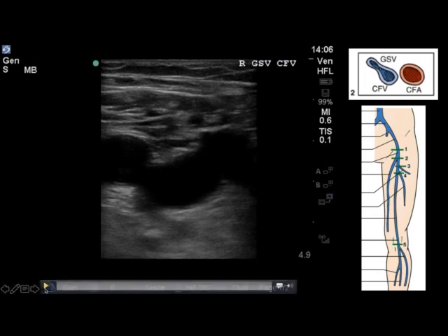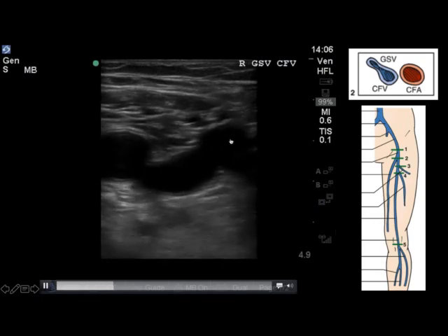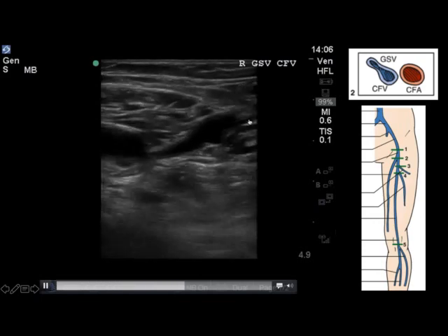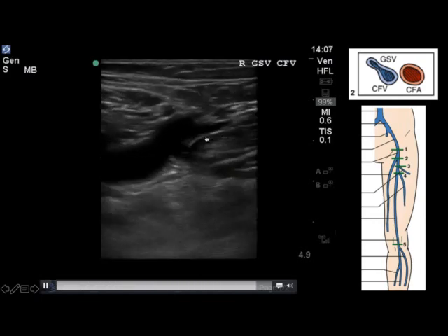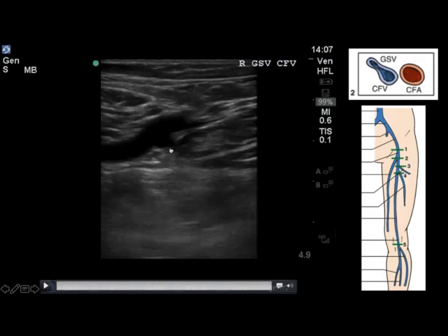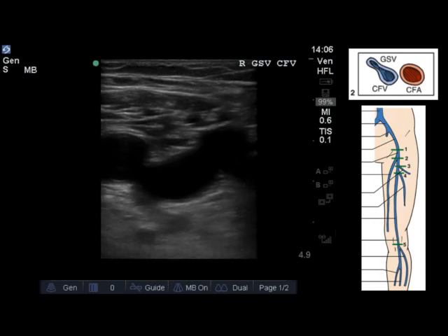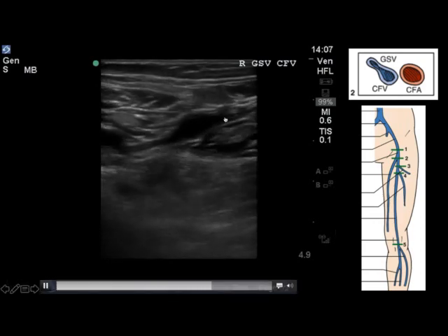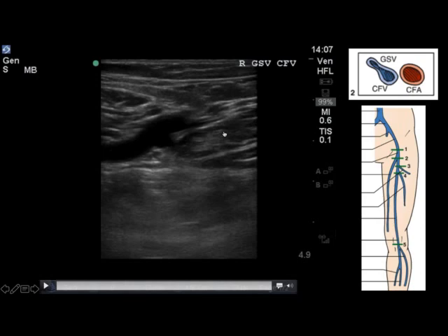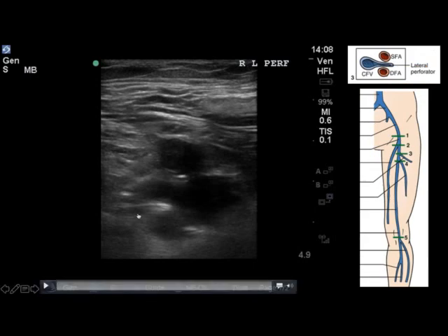The next site is the takeoff of the greater saphenous vein, seen here taking off superomedially from the common femoral vein. I drift the field of view a little bit such that we lose view of the common femoral artery on the left side of the screen, and then you'd follow the greater saphenous vein for the proximal few centimeters to ensure there's no clot hiding there that hasn't yet moved to the level of this second key point of vascular bifurcation.